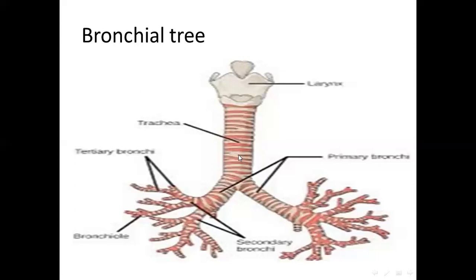So primary, secondary or lobar or intrapulmonary, and after that the segmental اللي هي الترشري bronchi.